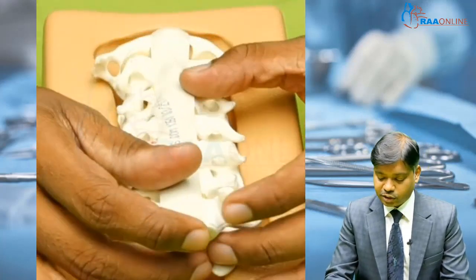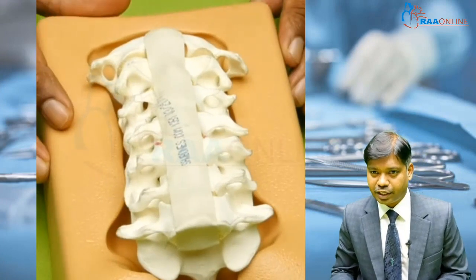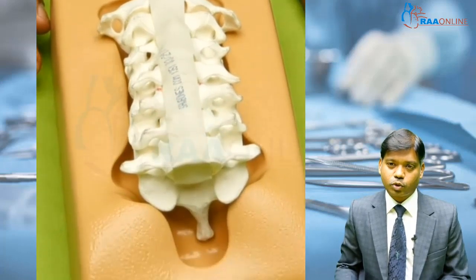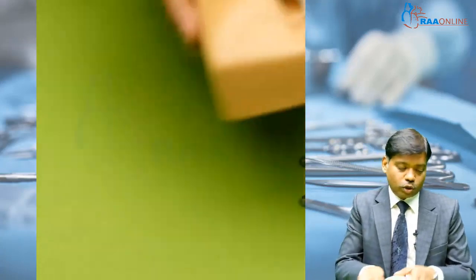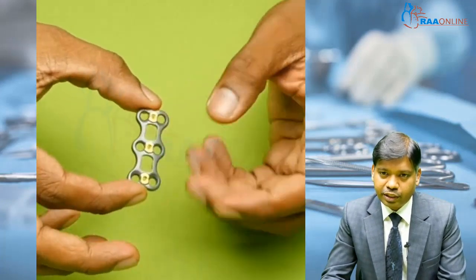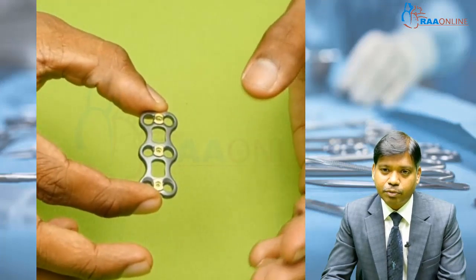So what are the systems that we commonly use for cervical spine instrumentation? Initially there were various instrumentation systems, but the commonly used one is called the anterior cervical plates and screws. So let us see one by one. So this is the anterior cervical plate. It has various categories. The sizes differ for a single segment to multiple segments.